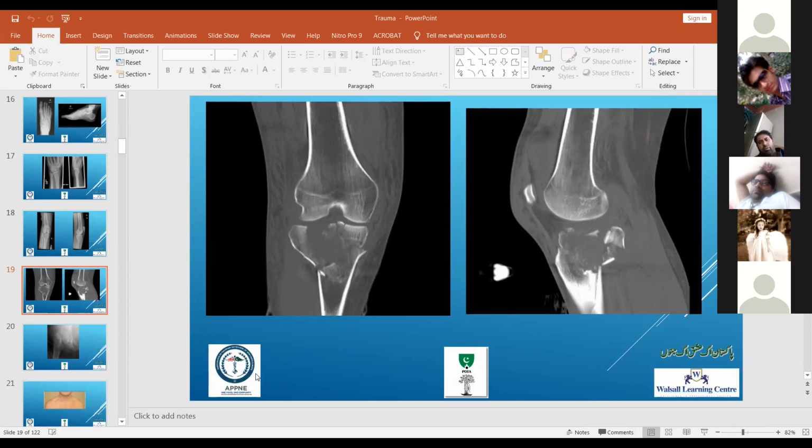In this particular case, the posterior condyle is very difficult. You have to fix it. The Ilizarov has got olives on it, and you can pull everything back. So in this particular case, we used three pins, and two of them were with olives, and we pulled it back, but we filled the whole of the middle with bone graft.